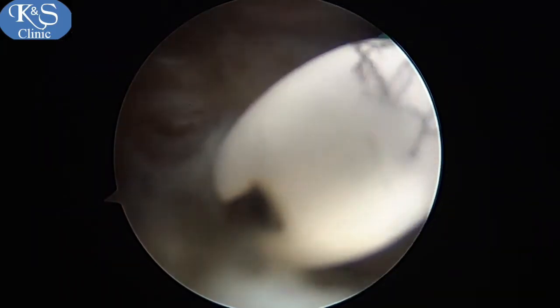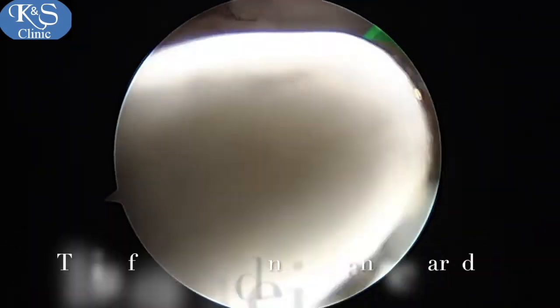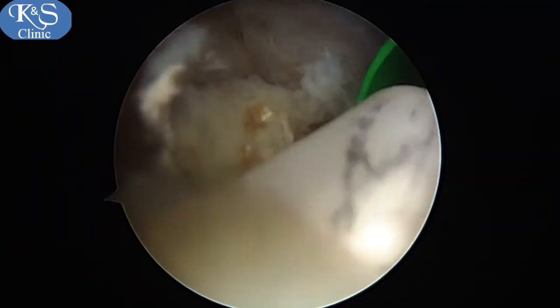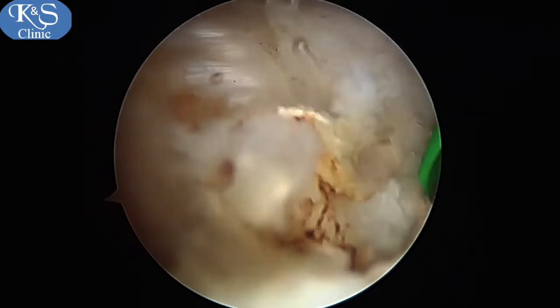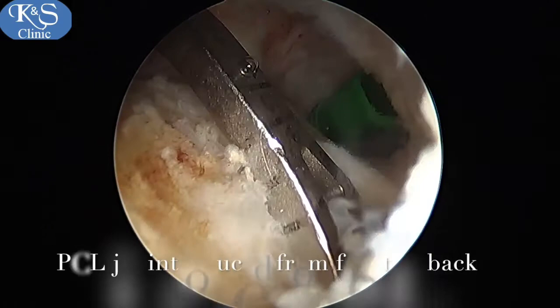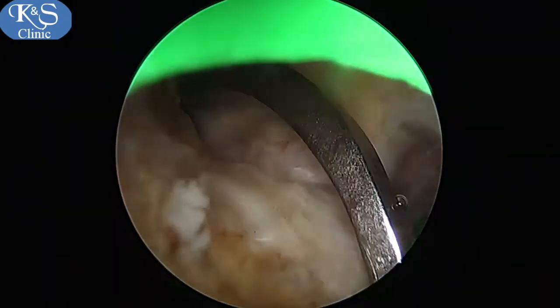Visualizing the knee from the posterolateral portal and working from the posteromedial portal, the tibial footprint of the PCL is identified. Any tissue around it is removed using a radiofrequency device to improve visualization of the footprint. A tibial jig is then introduced through the notch.